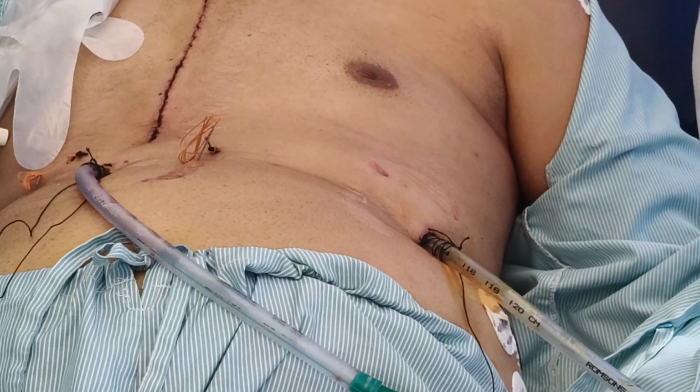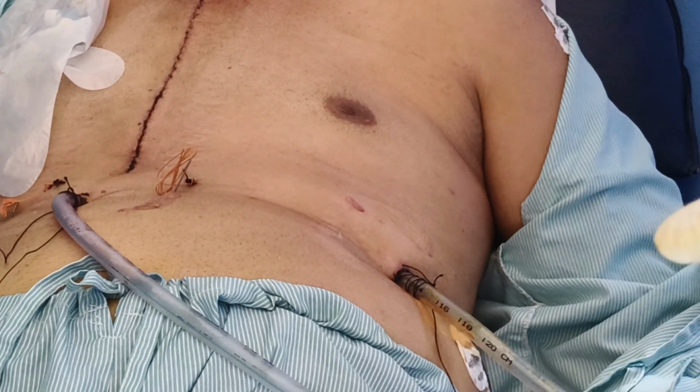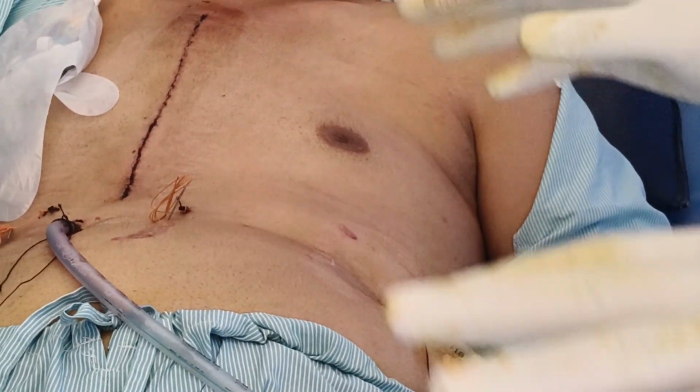Okay. When I instruct him, he has to do that. Now make him do that as a demo. You show it. First you make him take a breath in and hold.